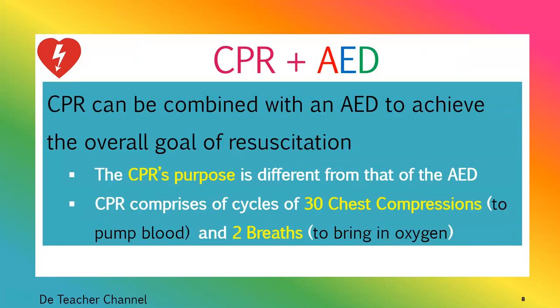CPR plus AED. CPR can be combined with an AED to achieve the overall goal of resuscitation. Remember that CPR is not the same as AED. The two could be combined to get the best result, even though each of them contributes differently toward the overall goal.